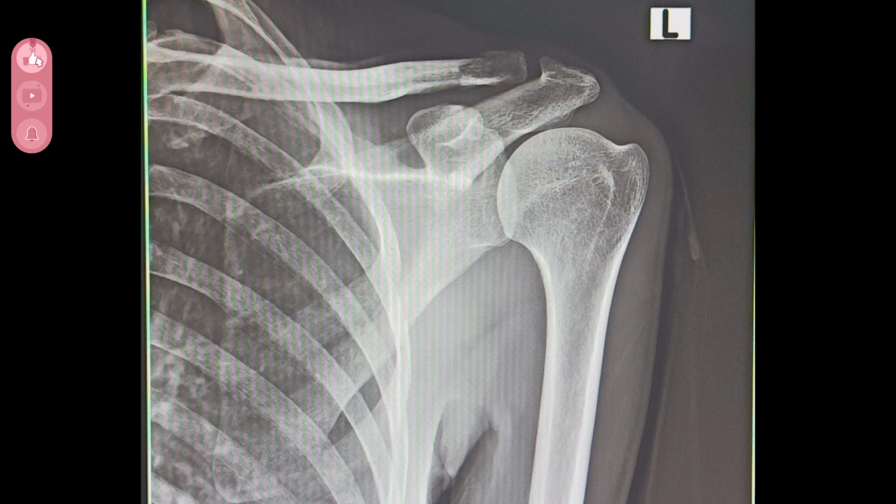That is precisely why we perform this crucial X-ray examination. There are numerous and diverse reasons why we critically need to perform this specific X-ray procedure for accurate diagnosis and treatment planning.